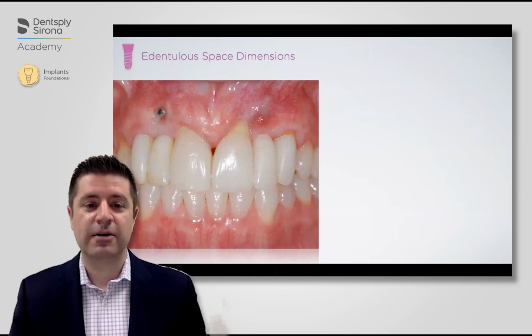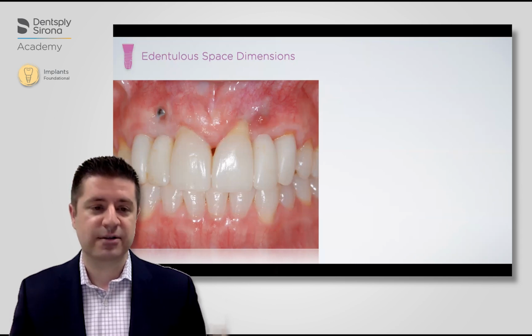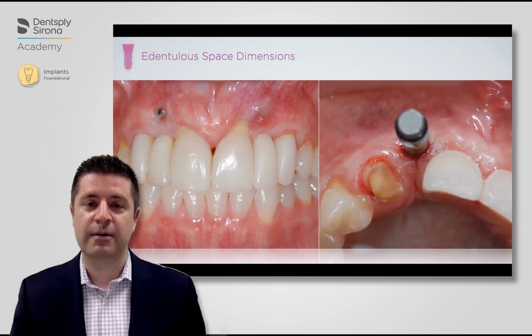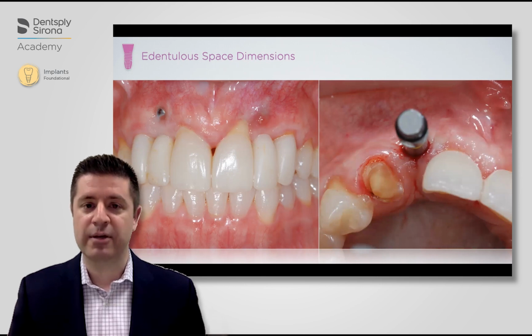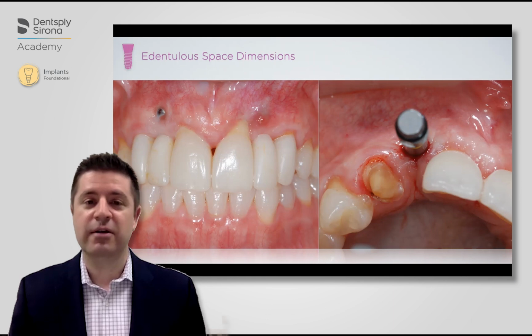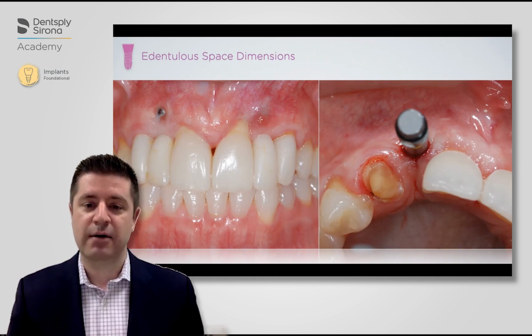In this case scenario, you can see that the patient had the implants placed and healed and had provisional restorations in traditional approaches with fixed partial dentures. She was ready to restore the definitive implants after being cleared. And unfortunately, when we uncovered the implants and connected impression copings, you can see that there was an obvious lack of attention and forethought going forward into planning where these implants should be placed, as well as whether there was adequate clinical space to even accommodate single tooth implant crowns.